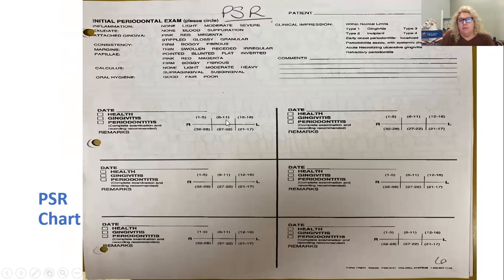And if all the teeth are 1s, they're going to put a 1 for that area. Then they're going to go around to 12 through 16. And if all the areas are 3s, they're going to write a 3, and so on for each of these quadrants. And of course, we're going to have the date and things like that. And then this would get scanned into the patient's chart if we're computerized or digital in the office, or if not, I have lots of different times that I can use this chart.